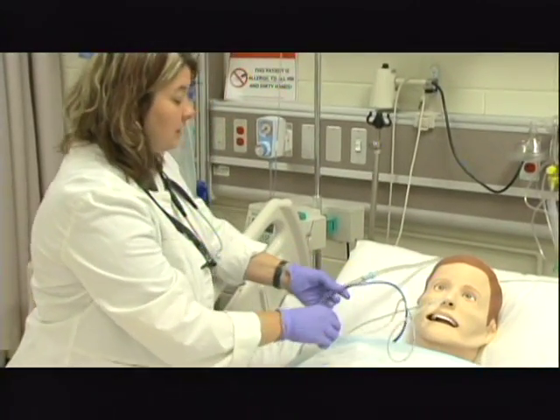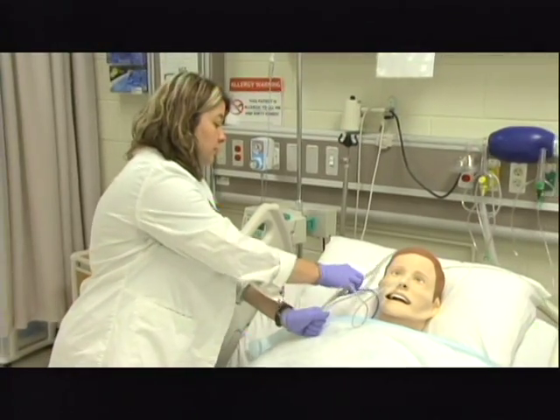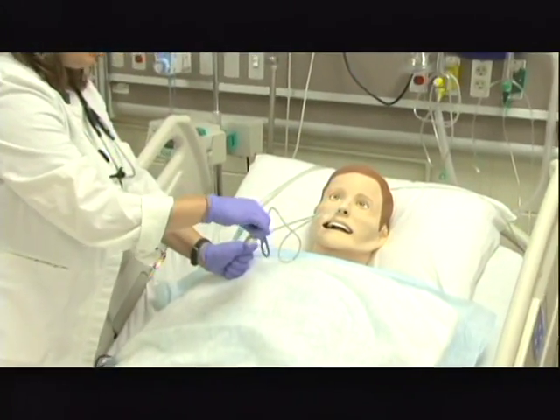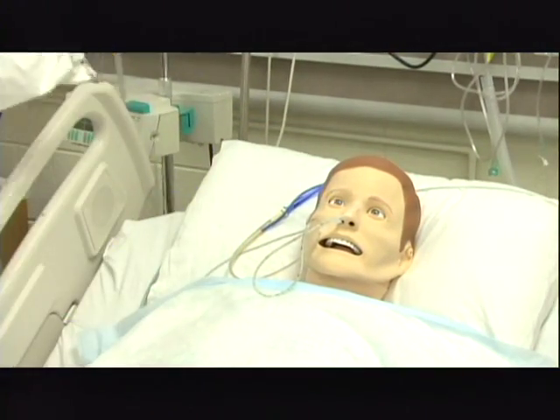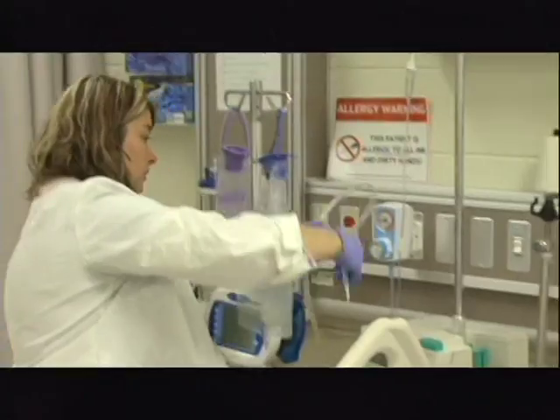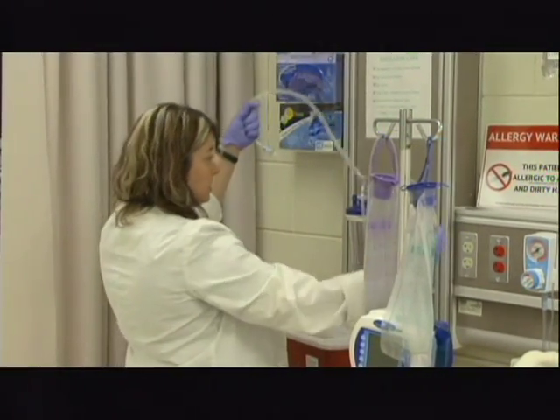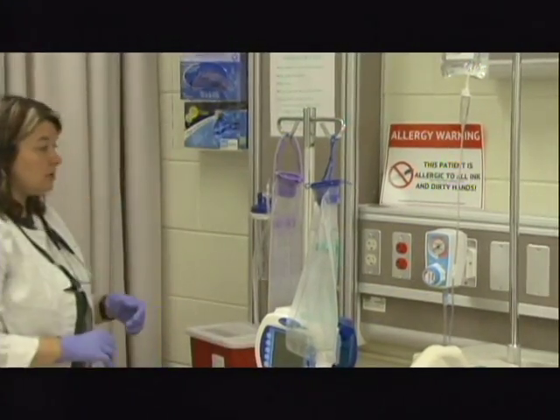As I'm coming through and I need to disestablish the suction, remember I always must clamp the tube first. I'm going to disconnect the suction and go ahead and put the anti-reflux valve back in my tube and keep this above the level of the patient's stomach. I'm going to then come over here and pull the tubing over here. Make sure it has suctioned out any secretions and stuff up into the canister. I'm going to go ahead and turn off the suction.